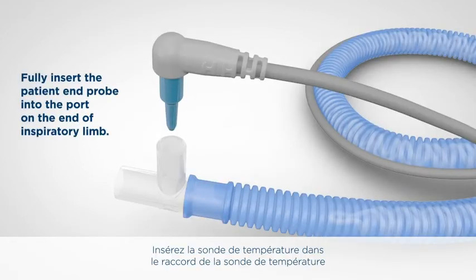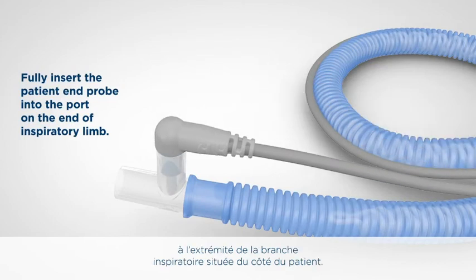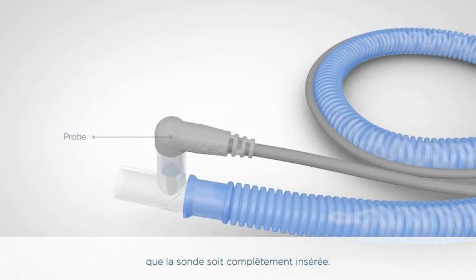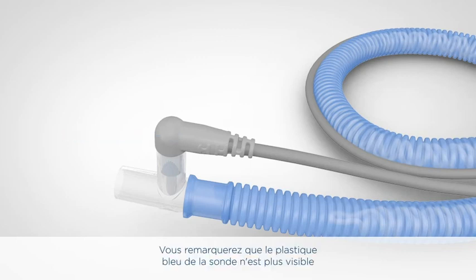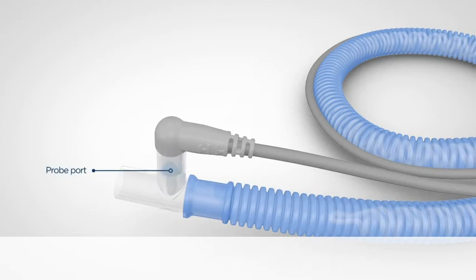Insert the temperature probe into the temperature probe port at the patient end of the inspiratory limb. It is important for correct function of the system that the probe is inserted fully. You will notice that there is no blue probe plastic showing outside the circuit and the grey plastic is seated against the probe port. We have now set up the inspiratory limb.